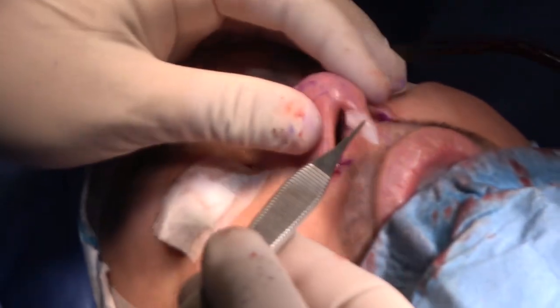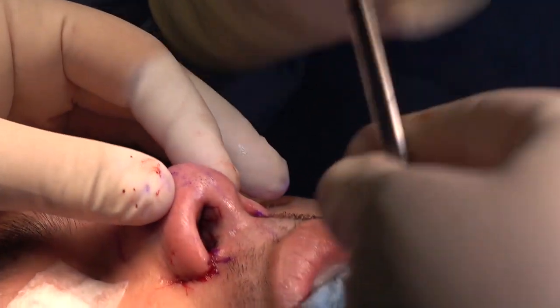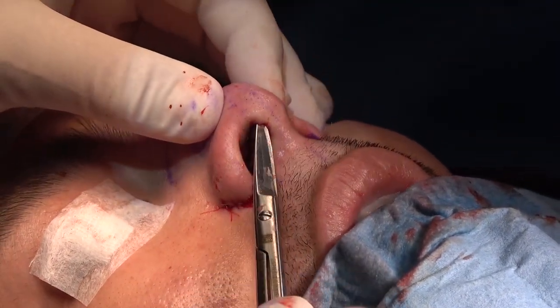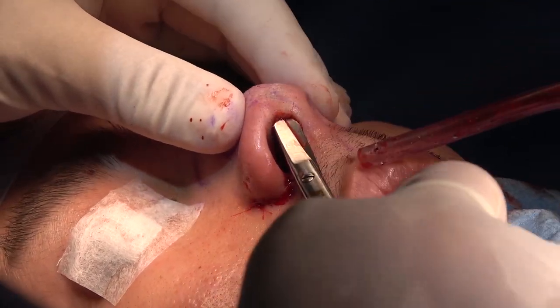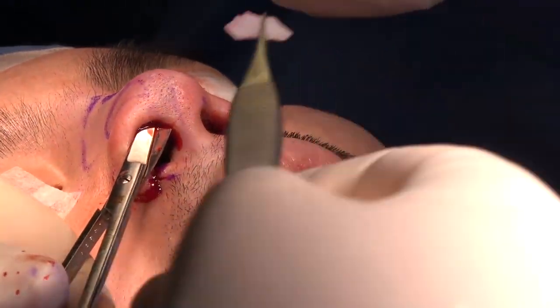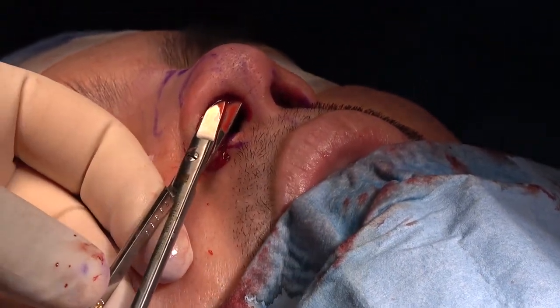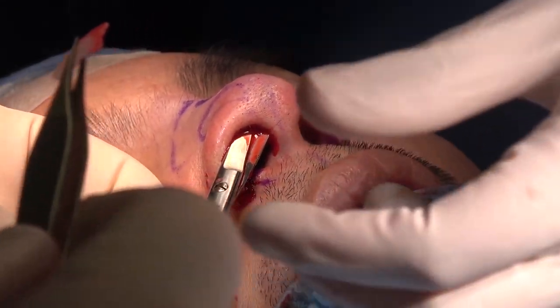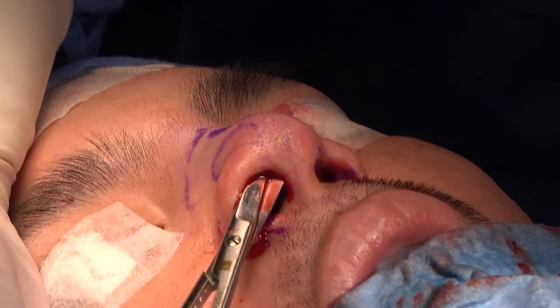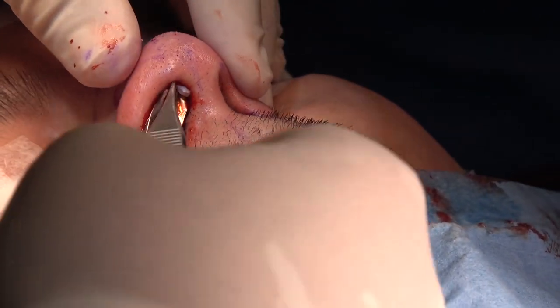See if we can push it. Give me non-toothed forceps, push it to this area. Hopefully it will improve. Hold for me, give me sharp scissors. Okay, let me just go. Okay, well, give me toothed forceps. Hold the scissors. Give me toothed forceps. Okay, go out.